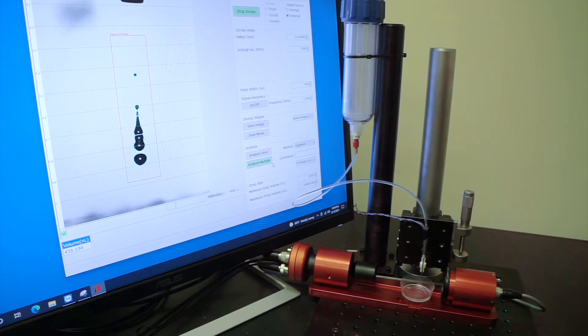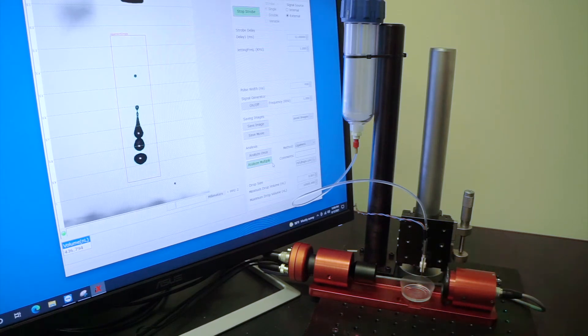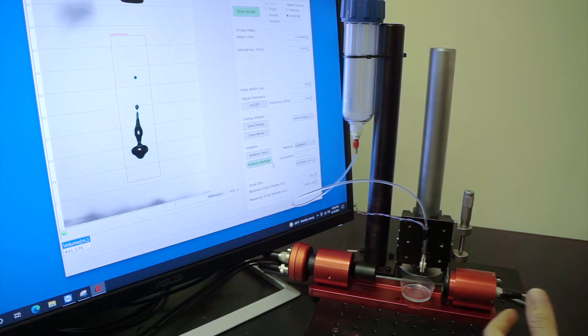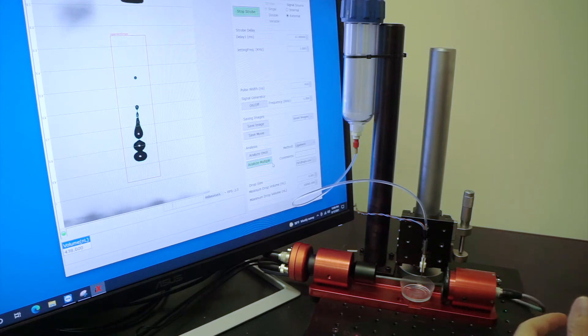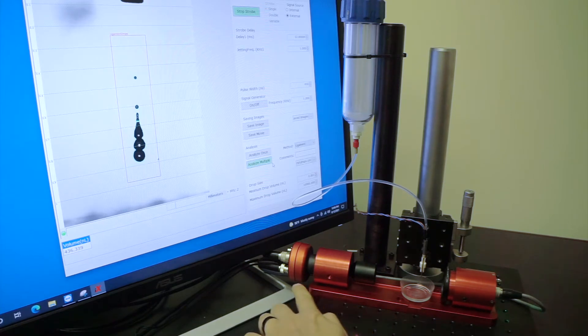It offers visualization of the drops as well as analysis of volume, velocity, satellites, and more.